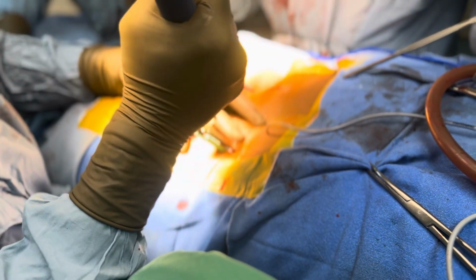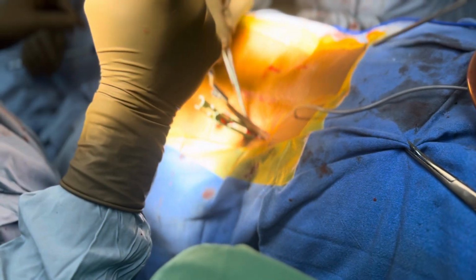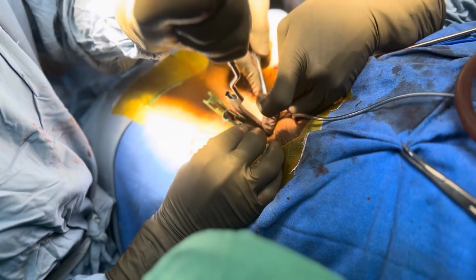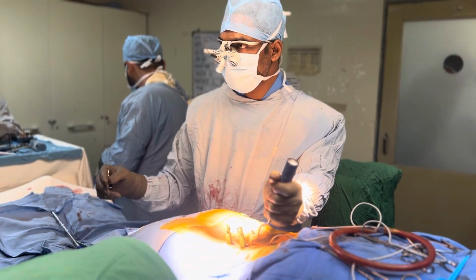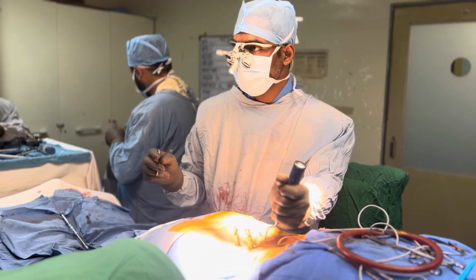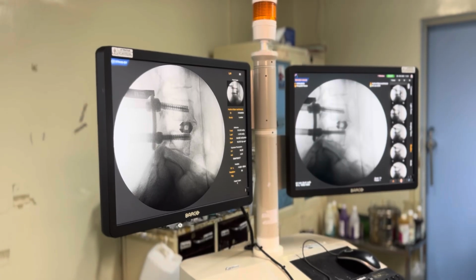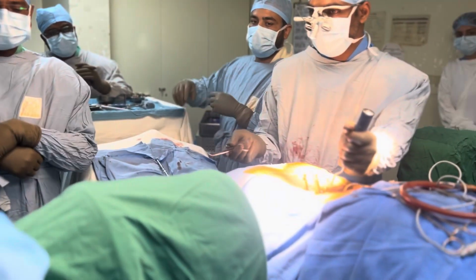You can confirm it under vision whether it is coming through the second sleeve, or there is one instrument to confirm whether it is in both the screws or not. The rod is inserted by my assistant standing from that side because I was standing from this side. Now if you see on the C-arm, both rods are overlapping, so we cannot confirm the length. So to confirm the length, one can elevate this end of the C-arm and take the oblique view.